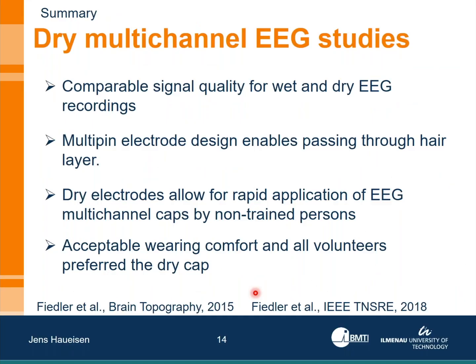With this, I would like to close this part of the talk, which is summed up here with, first of all, comparable signal quality for wet and dry recordings. The experience we have with this is now altogether beyond 100 recordings, beyond 100 volunteers being measured in such a comparison of wet and dry.